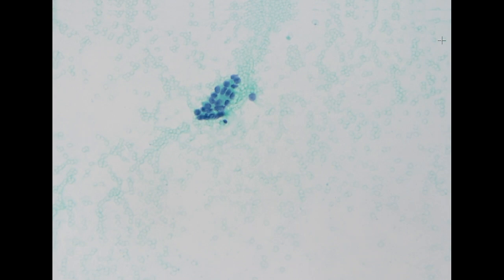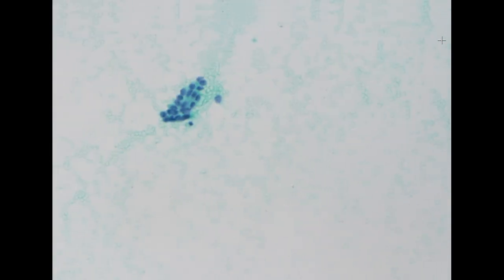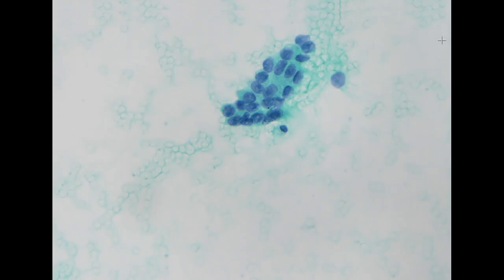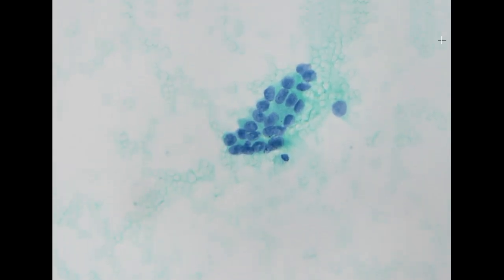pancreatic cancer. Then we have two bone aspiration specimens. Both are from relatively elderly males. For the first patient, he had a history of lung adenocarcinoma and prostatic adenocarcinoma. For this type of specimen, we realize that they have metastatic epithelial cells arranged in a glandular pattern.